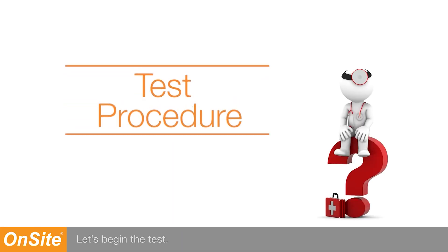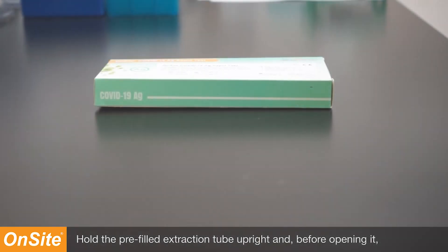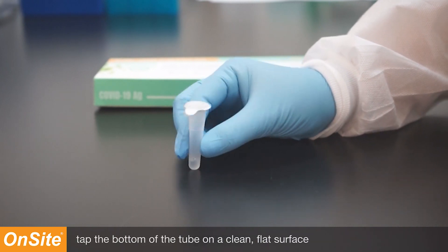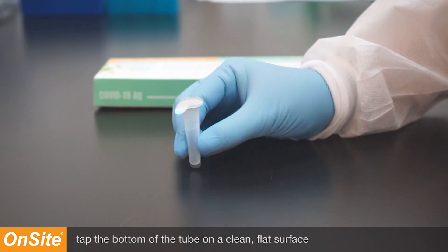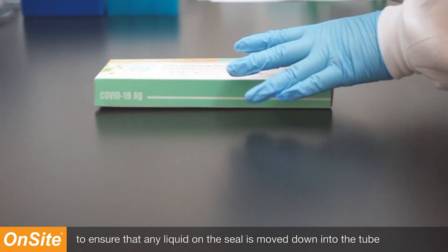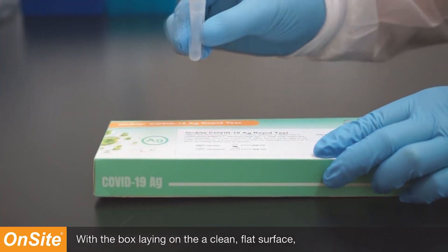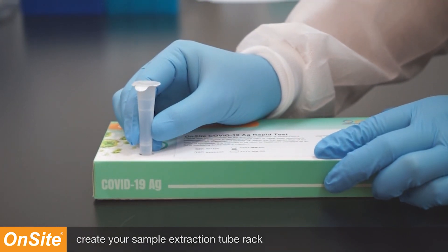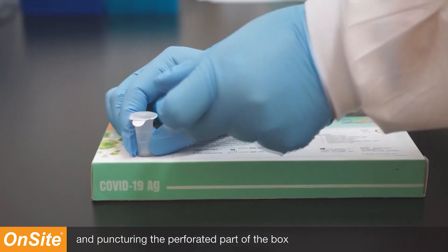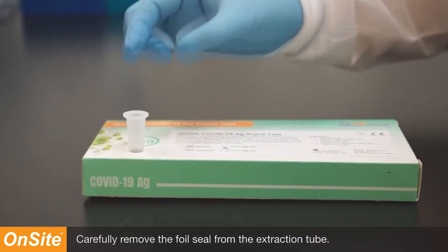Let's begin the test. Remove the test components from the plastic bag. Hold the pre-filled extraction tube upright and, before opening it, tap the bottom of the tube on a clean, flat surface to ensure that any liquid on the seal is moved down into the tube. With the box laying on a clean, flat surface, create your sample extraction tube rack by holding the extraction tube upright and puncturing the perforated part of the box with the bottom of the extraction tube. Carefully remove the foil seal from the extraction tube.